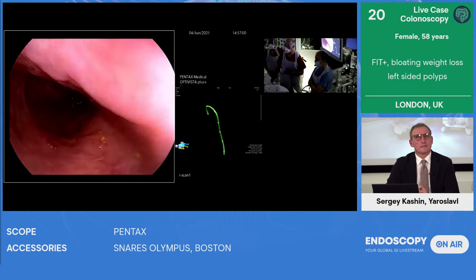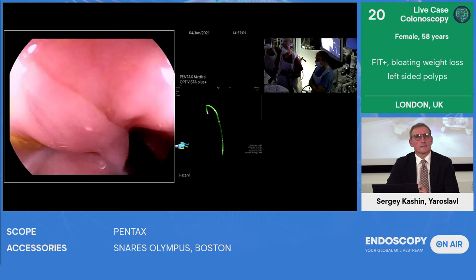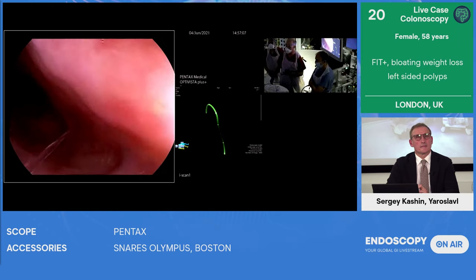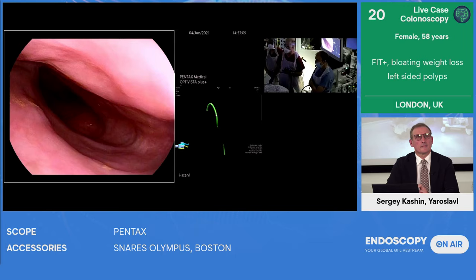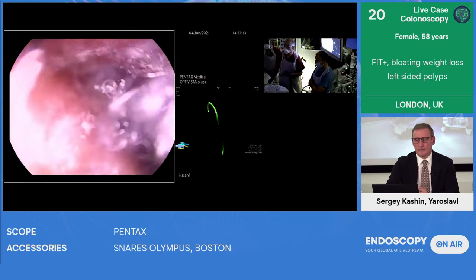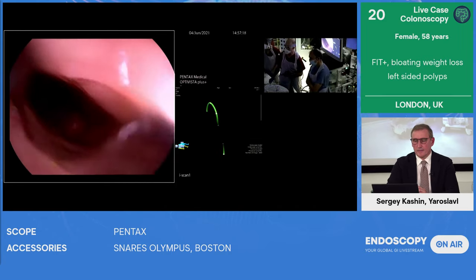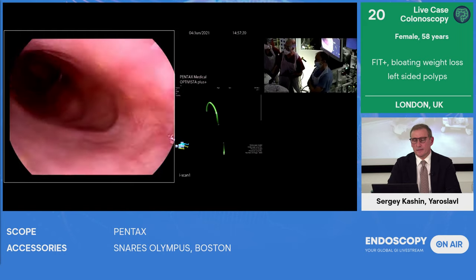I think where it'll come in particular is with quality control. There's all sorts of very simple metrics that can be done. For instance, recording the cecal intubation, the quality of the bowel preparation, that type of thing, giving you an automatic scoring in ulcerative colitis, for instance. And those programs are being worked on.